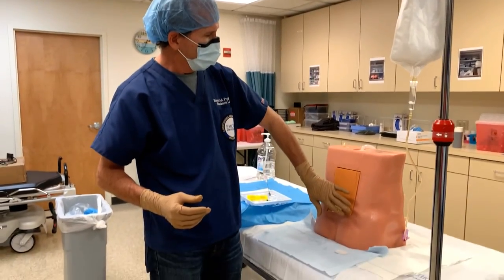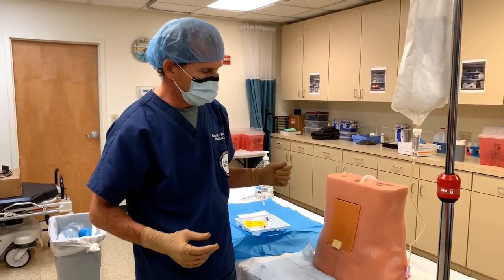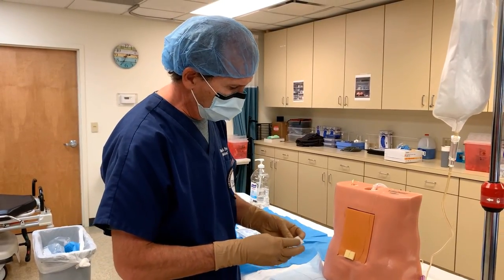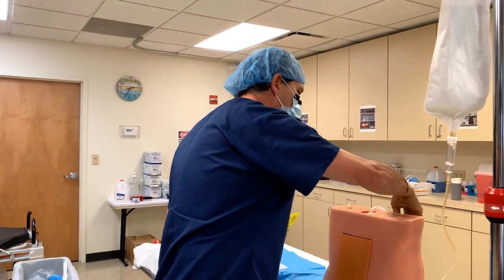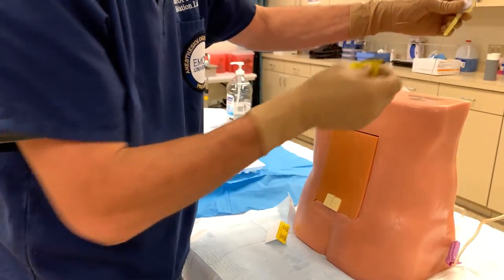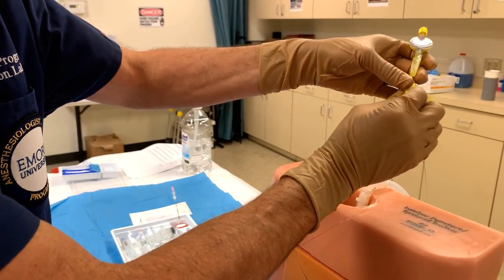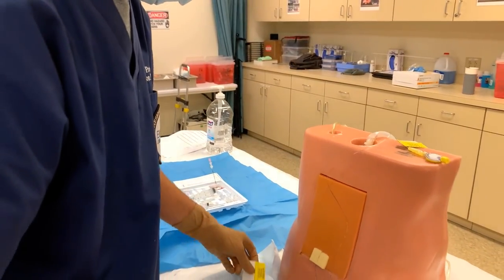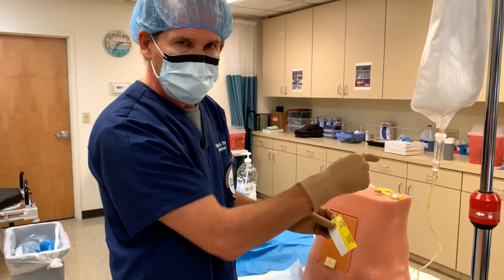We would place a Tegaderm over the puncture site, and probably some strips of two-inch tape up the patient's back and over their shoulder to secure it. The final step — and you don't want to skip this — is to place the epidural catheter caution sticker on the catheter. If you have an infusion, you'd take the other sticker and put it on the infusion line connected to the filter.